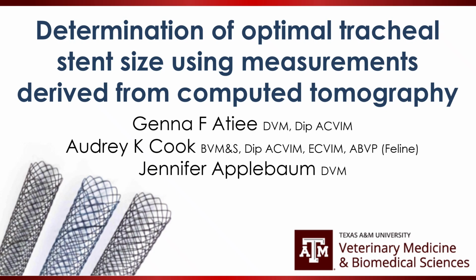Hello, we would like to share a method for determining optimal tracheal stent size using measurements derived from computed tomography. We have no conflicts of interest.